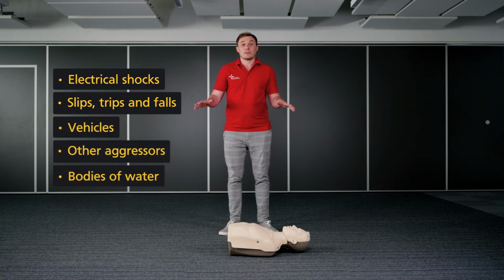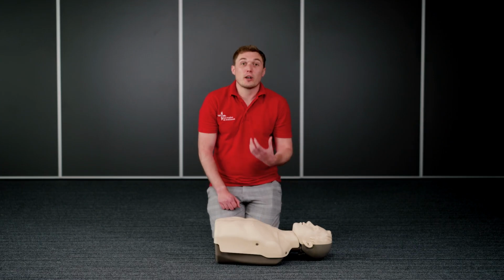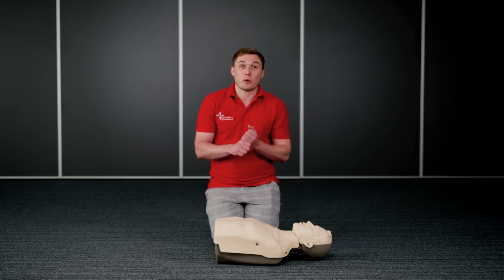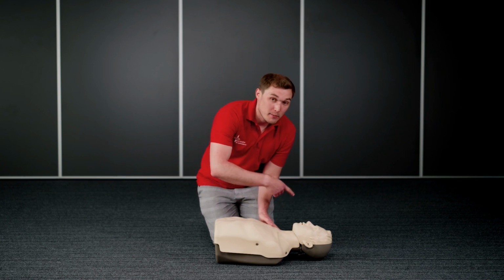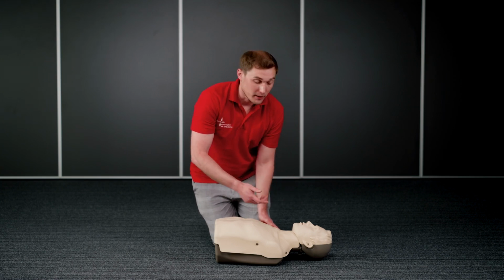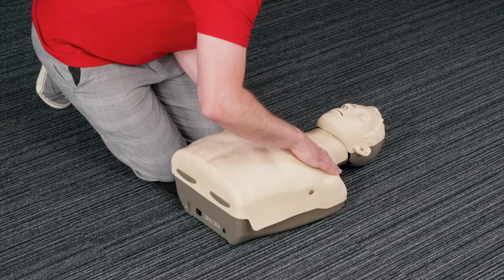After I've assessed any sort of dangers, it's safe for me to now engage the casualty. When someone goes in cardiac arrest, they become unresponsive. I'm therefore trying to check if they're awake and alert. To do that, I'm going to tap them on their shoulders and at the same time ask if they can hear me and if they can open their eyes. It should look something like this. Hello? Hello, can you hear me? If you can hear me, can you open your eyes?